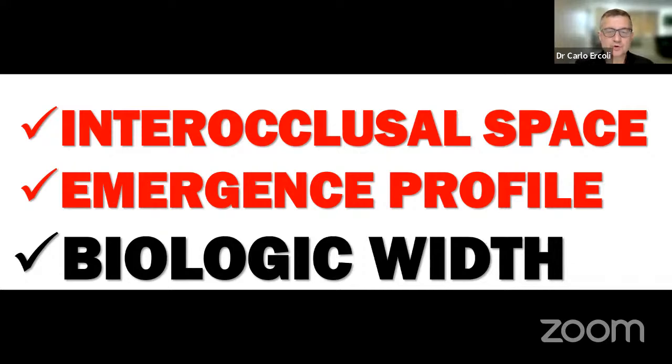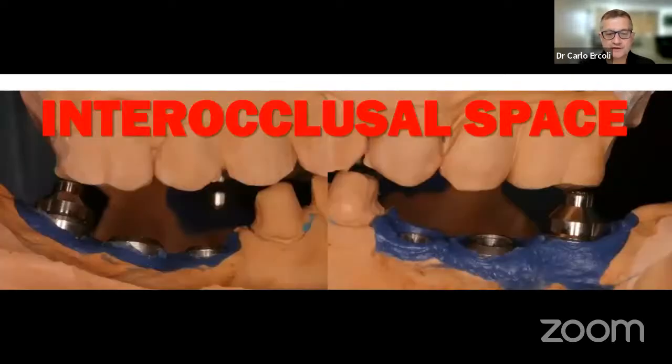Then we need to look at the emergence profile, which is important, although from an aesthetic standpoint, it is important for the establishment of what we call biologic width. So if you look at the obvious here, there are three implants placed a number of years ago. And as you can see, on the second molar, there is almost no space. There is a space only for a restorative component. So if you can't place a component there to make a tooth, then it becomes really irrelevant if you actually have placed the implant.